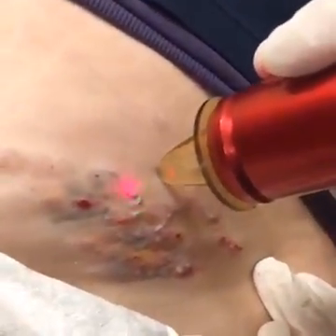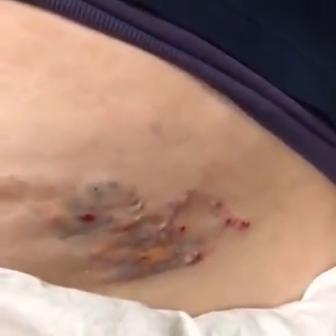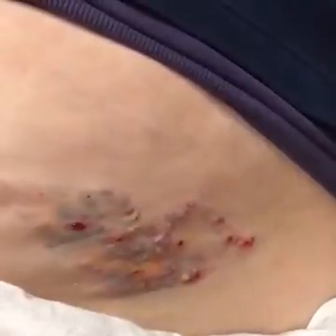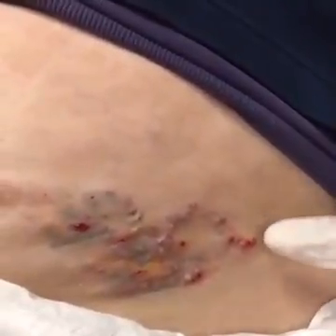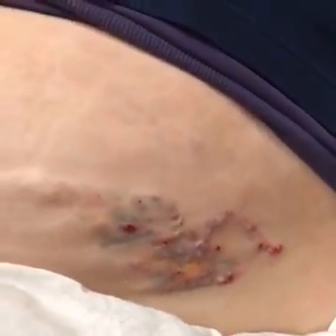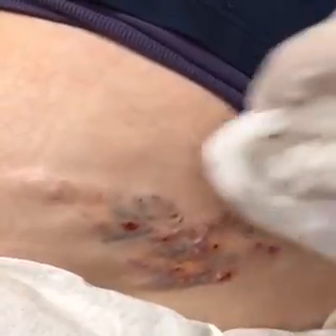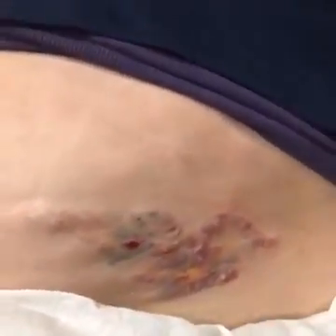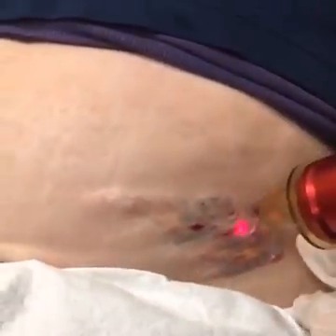Why don't you pause for just a minute and let them kind of see where you've lasered. If you don't mind pointing out to them the area where you've lasered, where it's kind of got that frothy, or that kind of bubbling there. So you can see here where it has bubbled or frosted, that's where I have already been. So that's kind of how I keep track of where I have been. Great. You doing okay, patient? She's not feeling anything. We'll get started again.